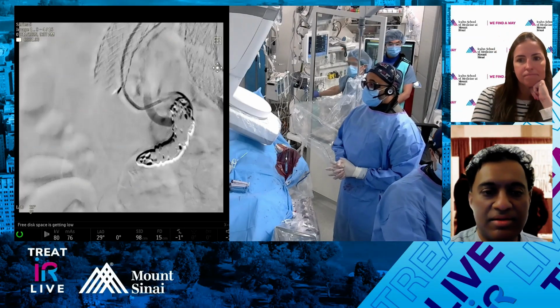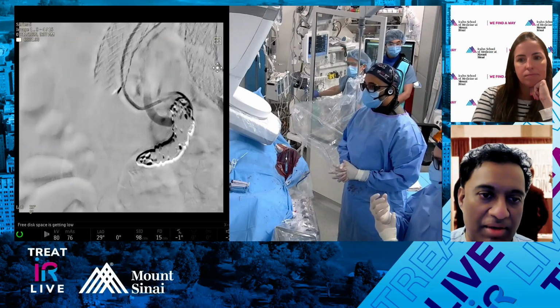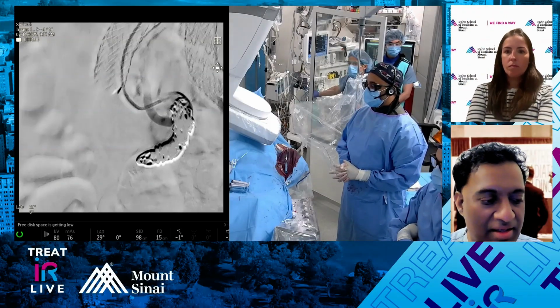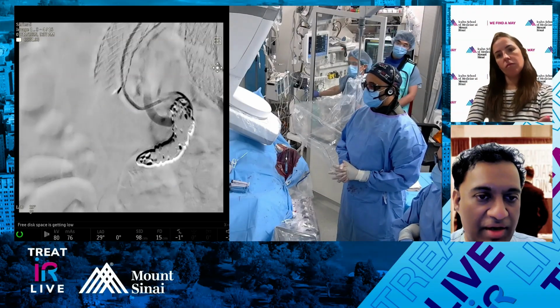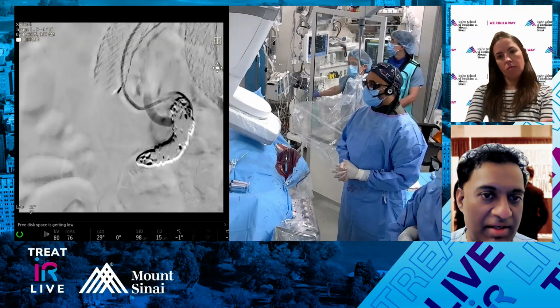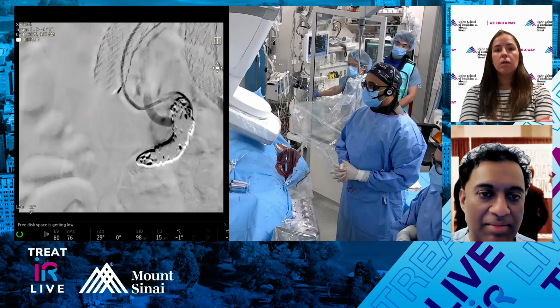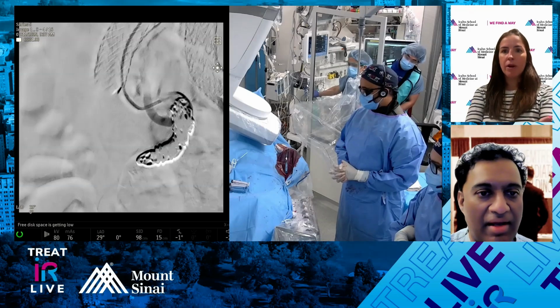Yeah, I mean, I think kind of the divisions is a great starting point, right above the bifurc. And putting that pod was a wise idea. I mean, the pod or high radial force coil there, and it worked out beautifully, right? And then you pack pretty aggressively with the floppy component and the packing coil. And what's your stopping point?